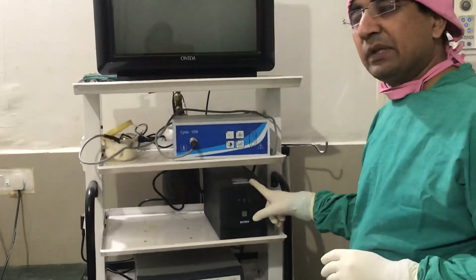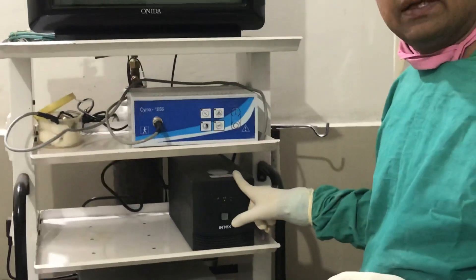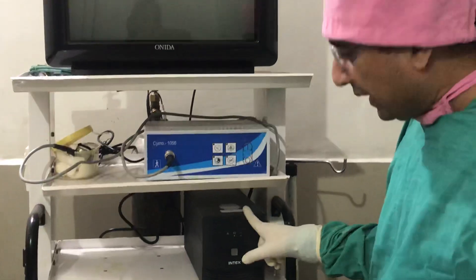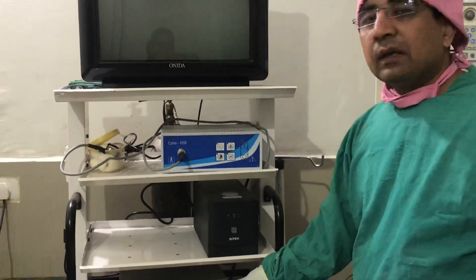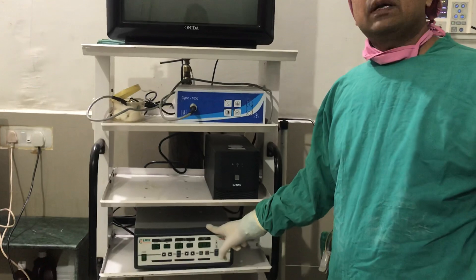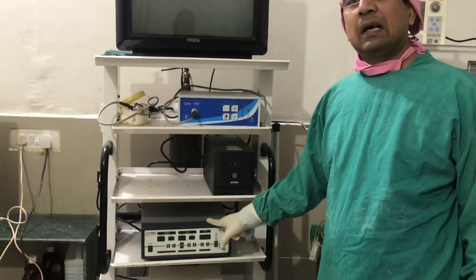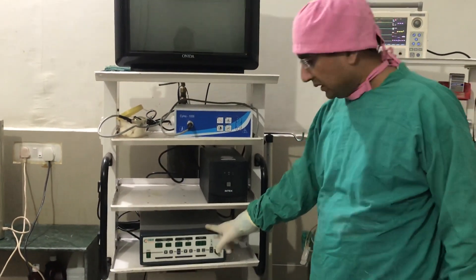The basic setup is a light source unit, and the patient is monitored. We use SPO2. We are going to use carbon dioxide and heat control to ensure that carbon dioxide is properly used.